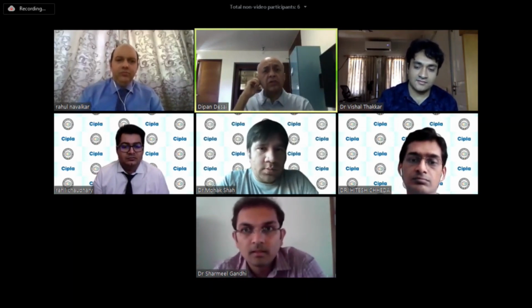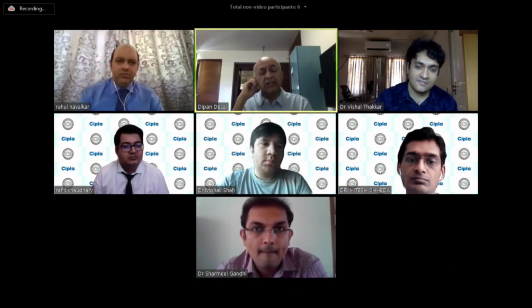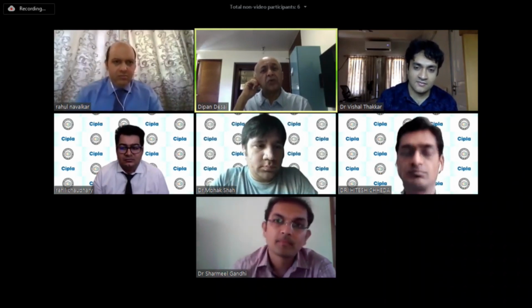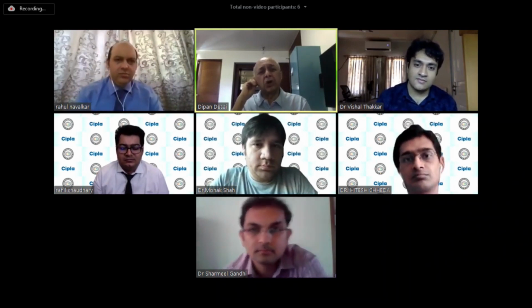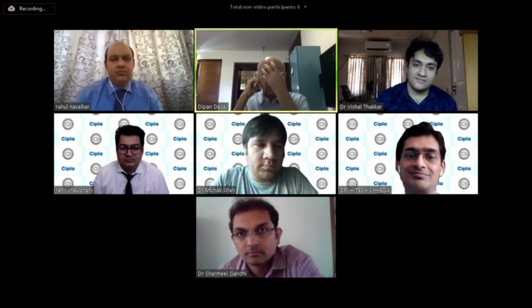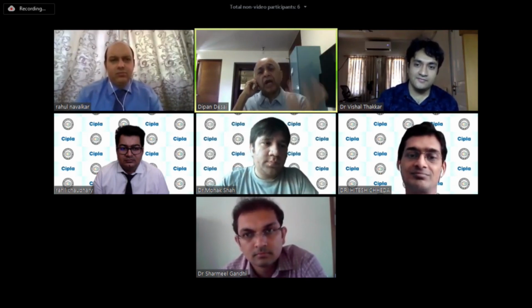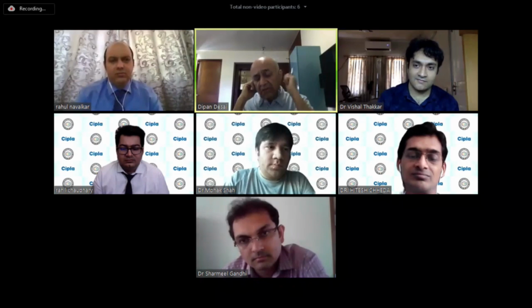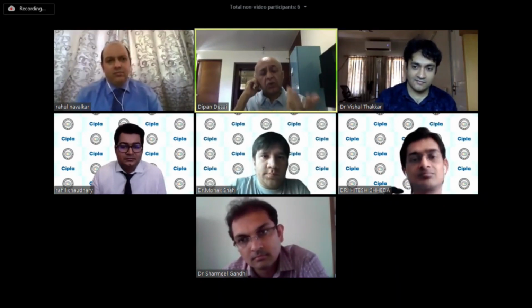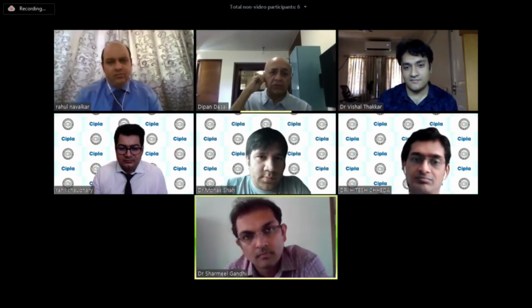And at least the Calhoun Vision light correcting lenses are FDA approved now, and people have started using them. The limitations are $6,000 for these lenses, and you have to wear dark glasses. You cannot allow the patients to have ultraviolet light for the first month, or at least 3 weeks. So there are a lot of limitations in these lenses, but they are the future.